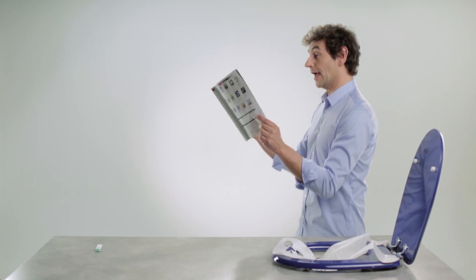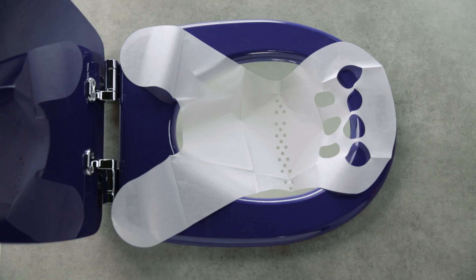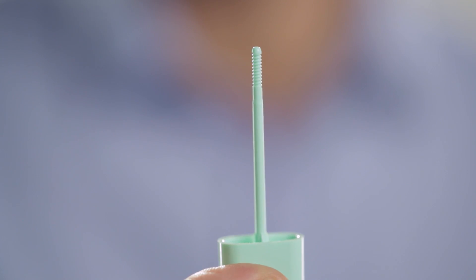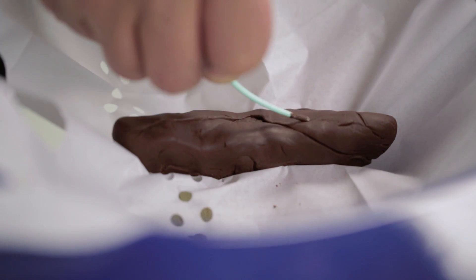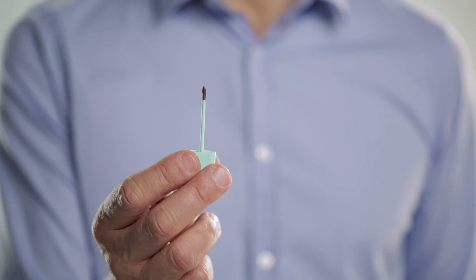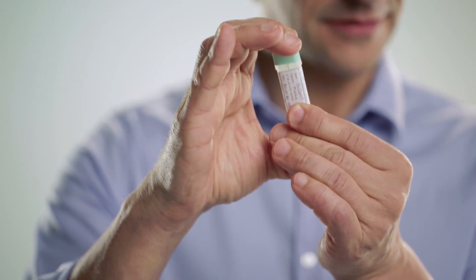And now proceed as usual. Open the tube by unscrewing the top, like so. The end of the stick has ridges — this is used to take the sample. Scratch the surface in several places until the ridges are completely covered. Now place the stick back in the tube, close it tightly, and give it a shake.